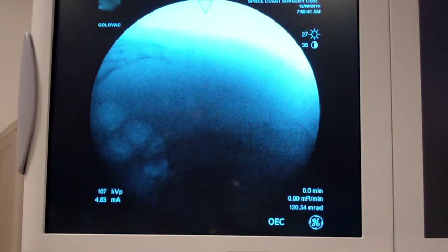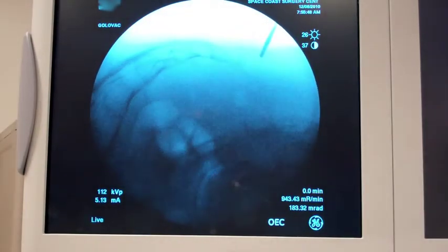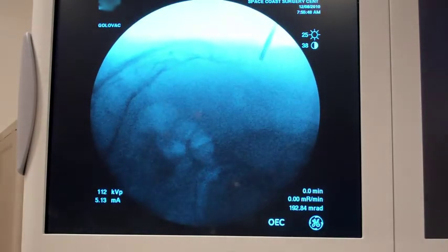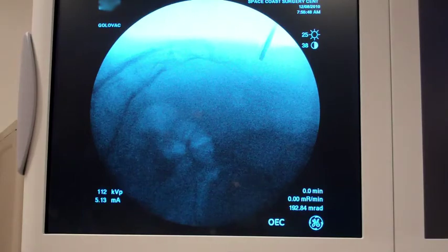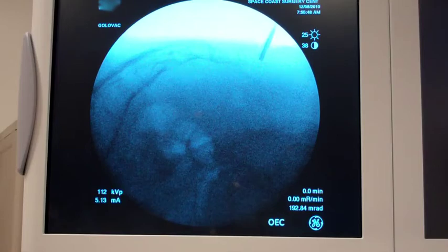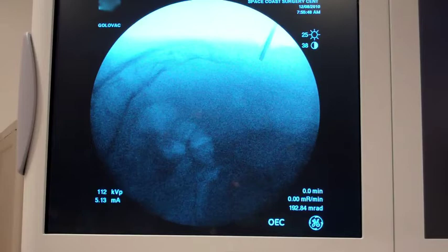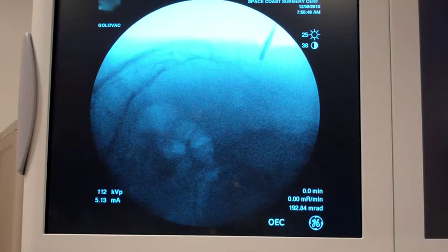Here we go with the ganglion impar block. We're going to first identify the sacral coccygeal junction, which we're going to anesthetize first — mosquito, sting, burn — here we go. And after initially anesthetizing the skin and subcutaneous tissue, we're going to allow the anesthetic to work and then use an angulated 25-gauge spinal needle to get underneath the sacral coccygeal junction.